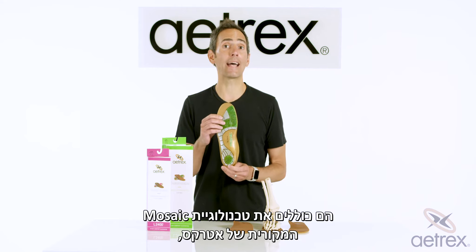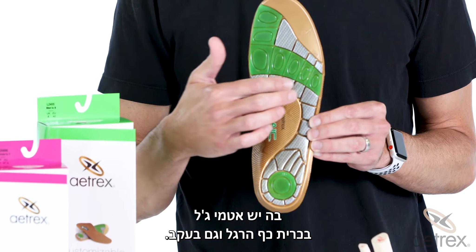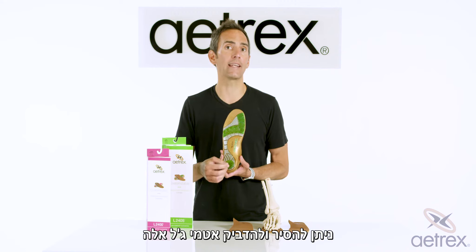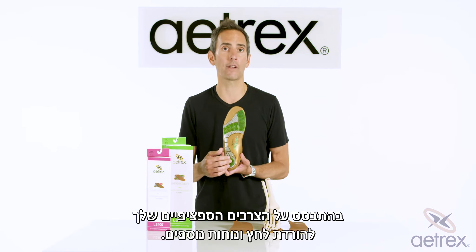They feature Aetrex's patented mosaic technology, which has gel plugs both at the ball of foot and at the heel. These gel plugs can be removed and adhered based on your specific needs for added pressure relief and comfort.